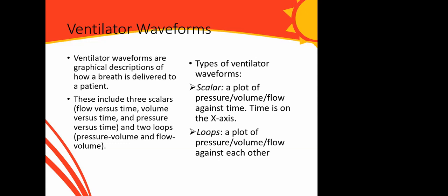If the problem is with the expiratory, I think the higher pressure should be applied in order to mitigate this problem. I don't know why this is so. I just want to ask if there is any explanation.